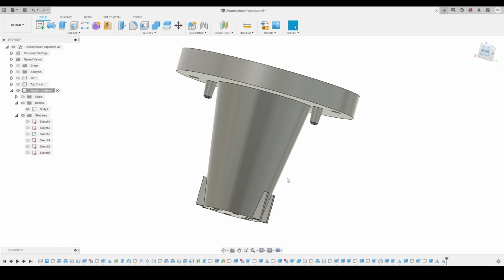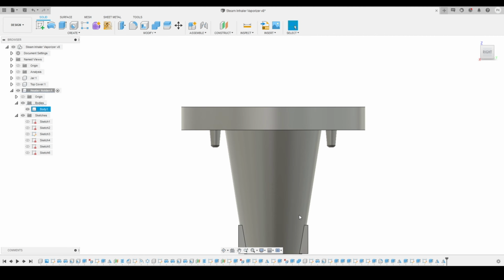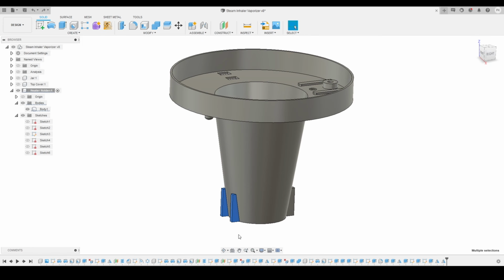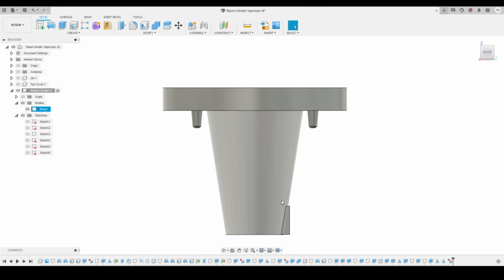This thing is just to separate the coils. So I will select all these things. Here is a trick I'm going to show you. I will use my mouse to select these profiles and press delete on my keyboard. Here you can see I'm selecting these features. It is not working in this shape because I'm not able to select this particular feature.